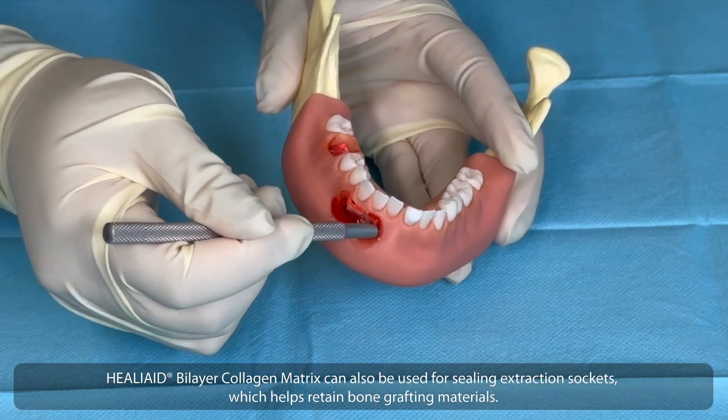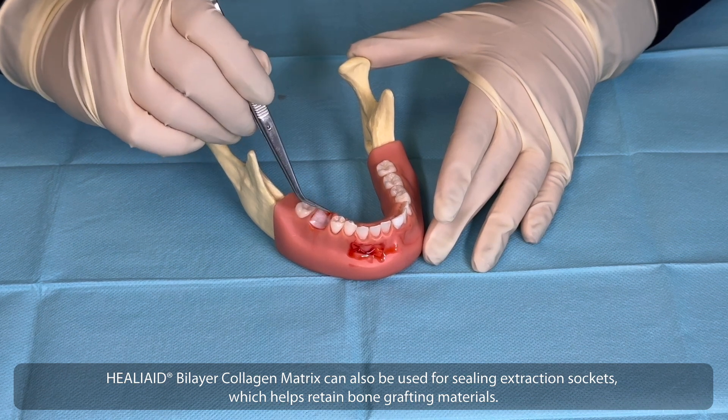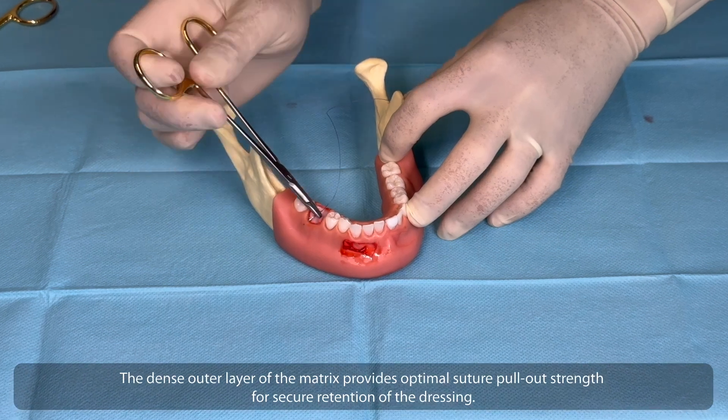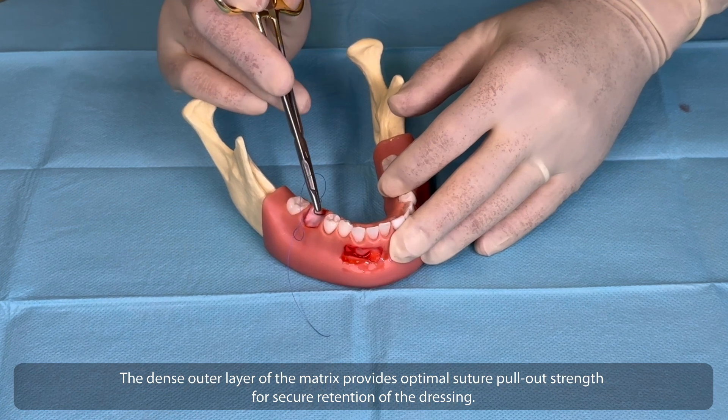HEALIAID Bilayer Collagen Matrix can also be used for sealing extraction sockets, which helps retain bone grafting materials. The dense outer layer of the matrix provides optimal suture pull-out strength for secure retention of the dressing.